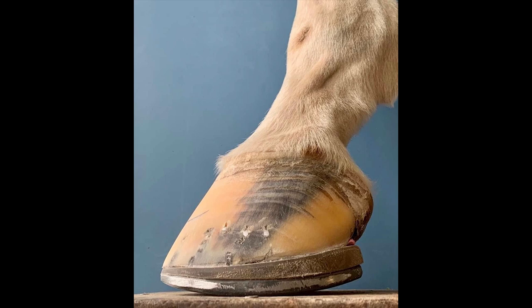On this horse, we've decided to use a full roller shoe. The full roller shoe is a radial shoe placed on the foot with the center of rotation directly above the belly of the shoe. This shoe reduces load on the deep digital flexor tendon, the toe, and as such, the laminae. It also eases the landing phase of the stride, which we often see exacerbated in laminitic horses.